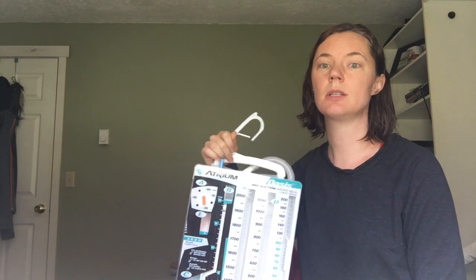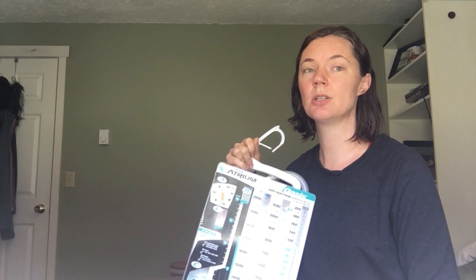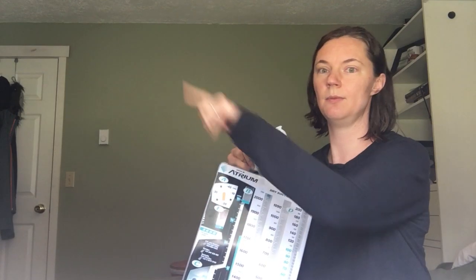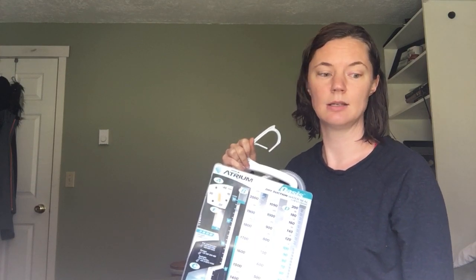If they don't have orders that it's okay to come off suction, say they have a really bad pneumothorax and the doctors want them to stay on continuous suction for 24 hours, we have a portable suction on 2R. You can order a portable suction. Or you can just walk them in the room, just march them back and forth from one end of the room to the other and back again. That's still walking. It's boring walking, but they still need it to help with recovery.